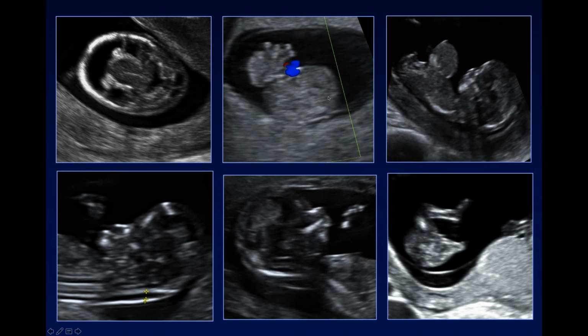This is an axial scan through the fetal abdomen. We often should be looking at the umbilical cord insertion site, and you can see this irregular mass projecting from the anterior abdominal wall and a right paramedian defect in a fetus with gastroschisis. Or this fetus, where on mid-sagittal view you can see a large liver-containing omphalocele. We can look at the extremities.